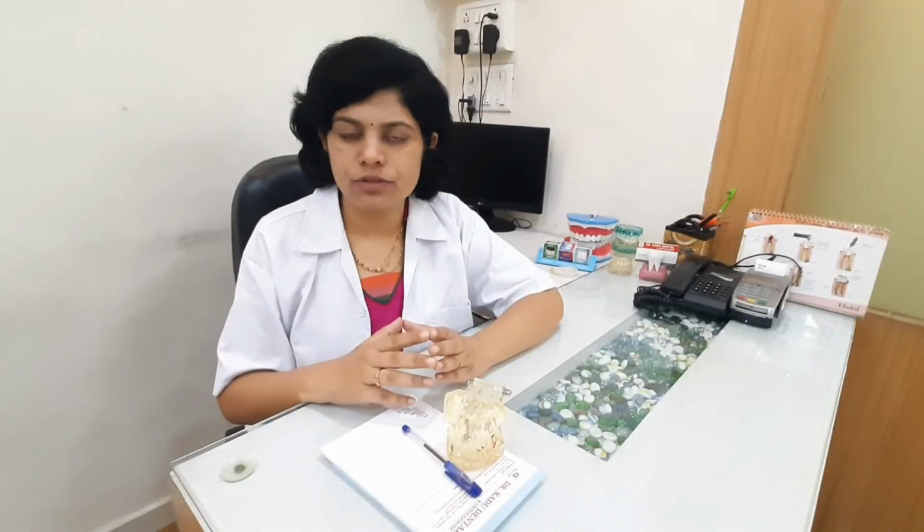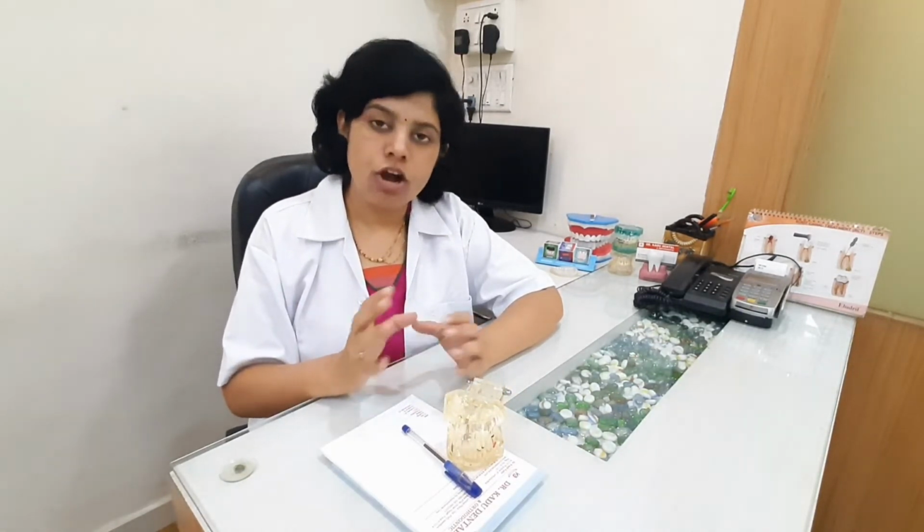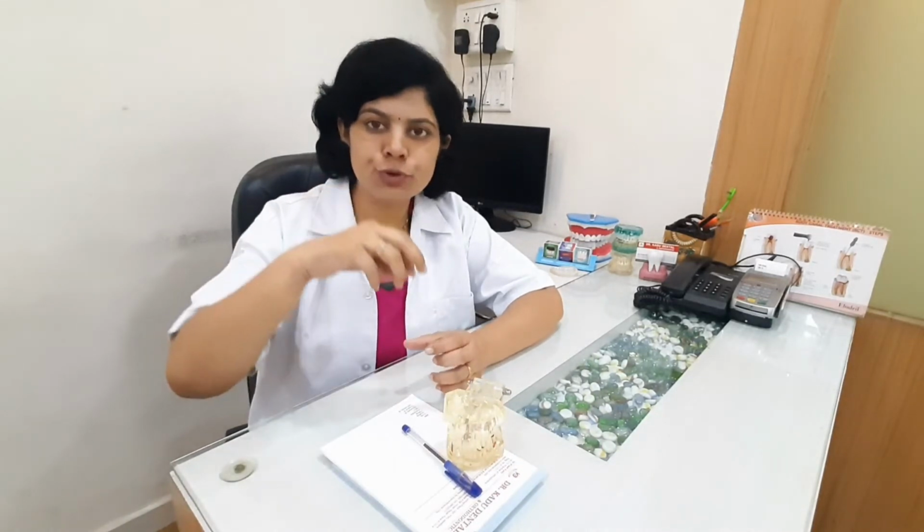Fixing of the crown on the implant is done in two ways. Sometimes the crown is just cemented on the implant abutment, or sometimes the artificial crown is screwed on top of the implant. In your case, which type of crown fixation is required will be decided by your dentist. Once your crown is placed, you can chew with the implant-supported artificial tooth just like any other natural tooth.